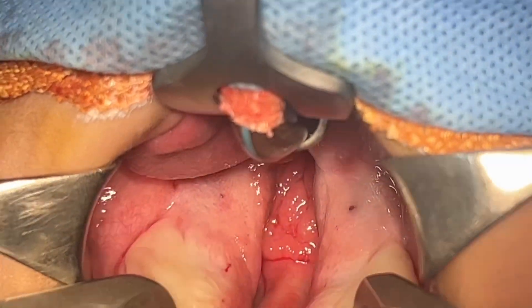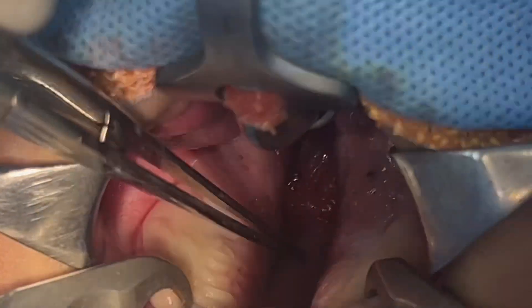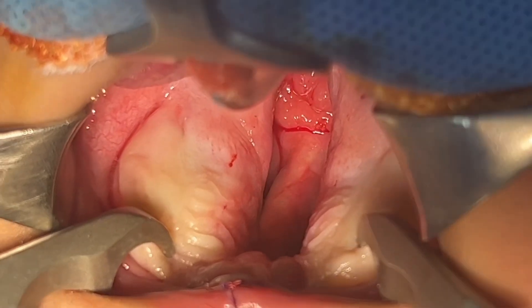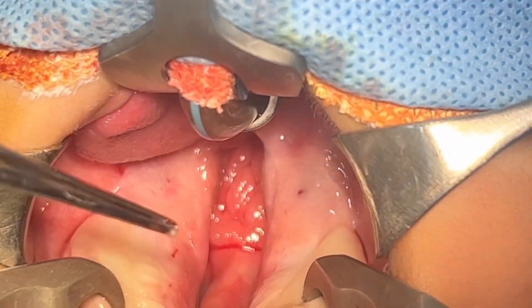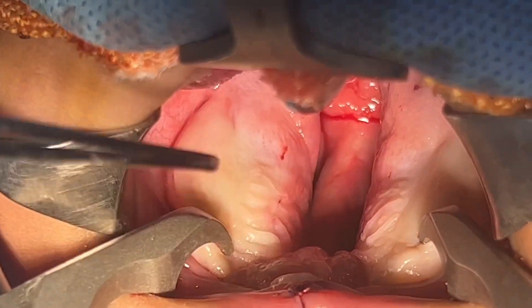What you're seeing is the bilateral cleft palate — we're just going to start the repair. You can see the vomer bone here, that's the midline; it's not very wide though. We still have to get it together with no tension and good muscle reanastomosis. On this side we're planning a two-flap procedure for this patient. One tooth — you can see it just erupted here — this child is 10 months of age.